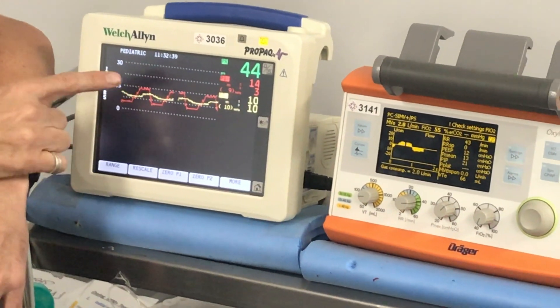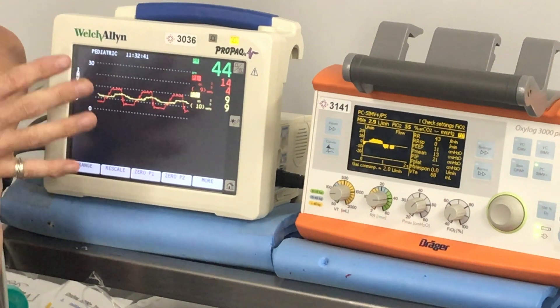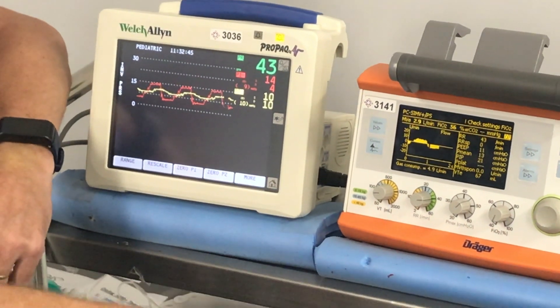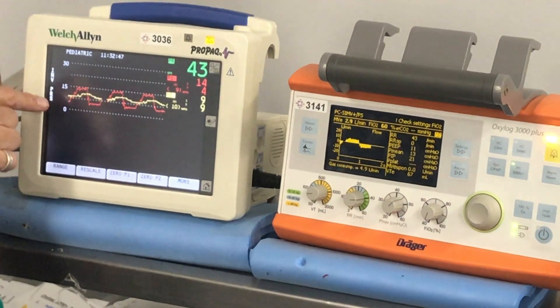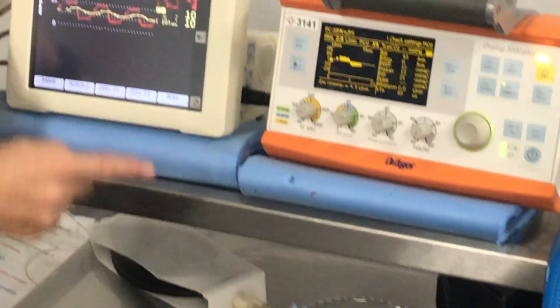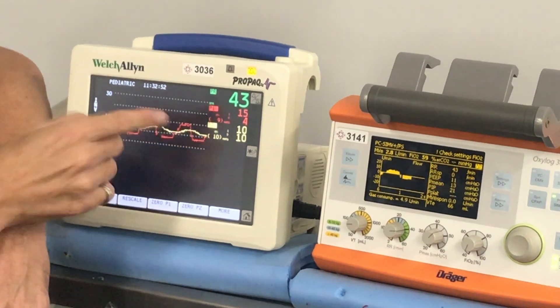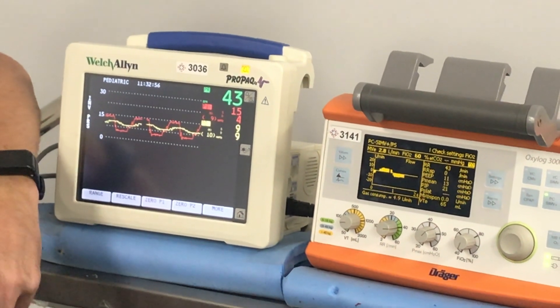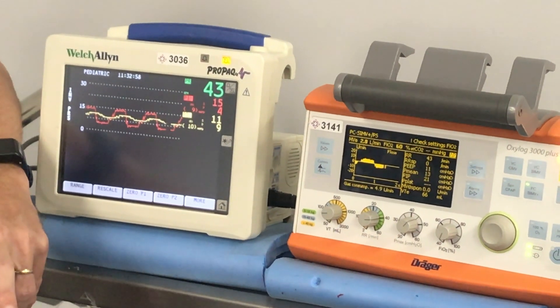Pre-switch it was reading about 15 on 4, it's now reading 14 on 4 — so there hasn't been a great change in what the machine thinks it's doing. But if we look at P2, which is what we're generating at the end of the tube, you can see we've essentially got 10 on 10 with a mean of 10 — so we're not really moving any air in and out.